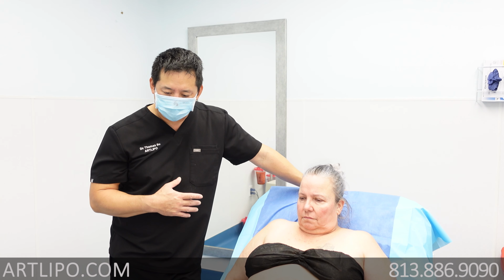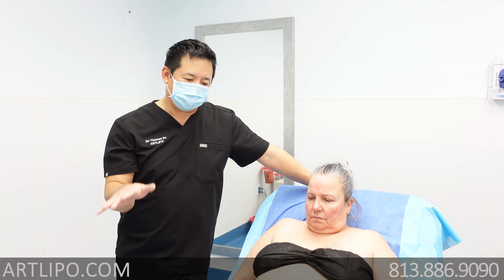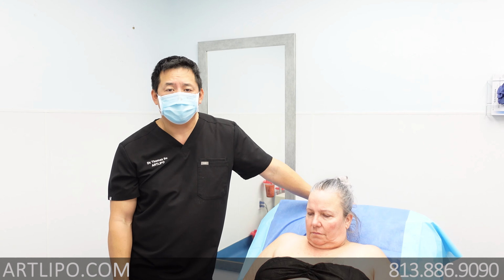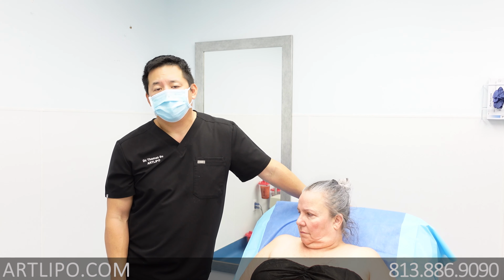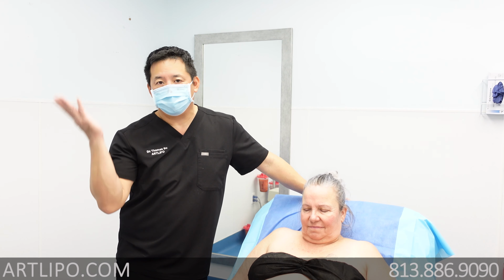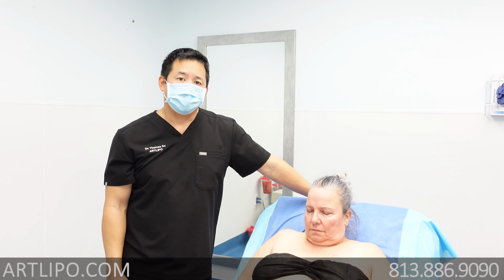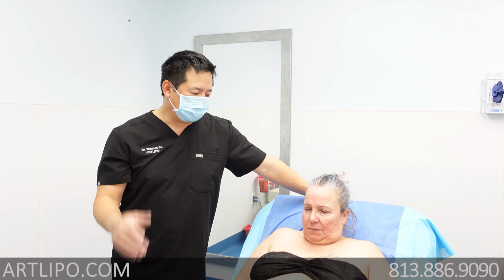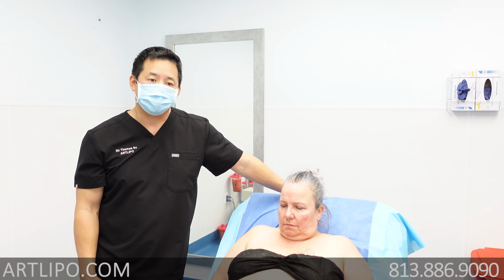In Susan's case today, we are only doing one leg, and we did her right leg. Tomorrow we're going to do her left leg, because we do have limits of what we can remove. We have a 4-liter limit of fat, and we've removed a little over 3 liters of fat already. So if we had doubled that for 2 legs, it would have been 6 liters, and we couldn't have done that without breaking the state of Florida rules. And it's a little bit safer too, because we don't use as much lidocaine at one time, which would be one of the other things difficult to keep within that limit.